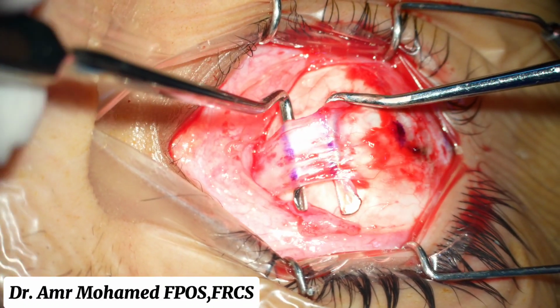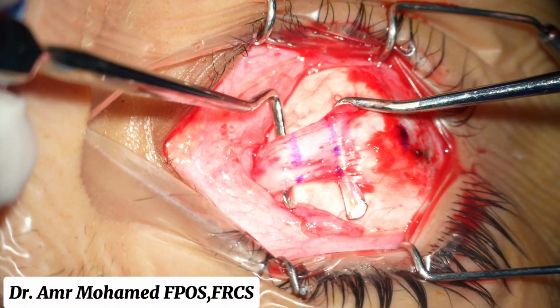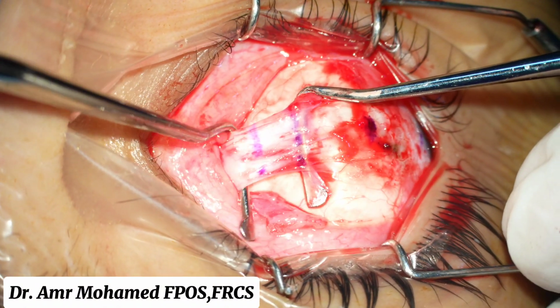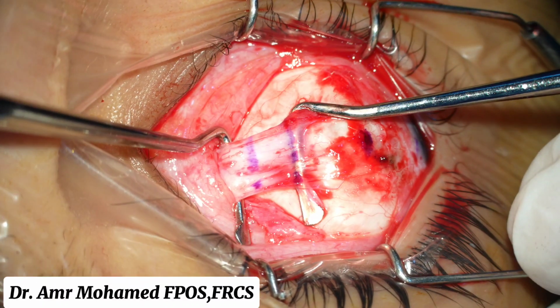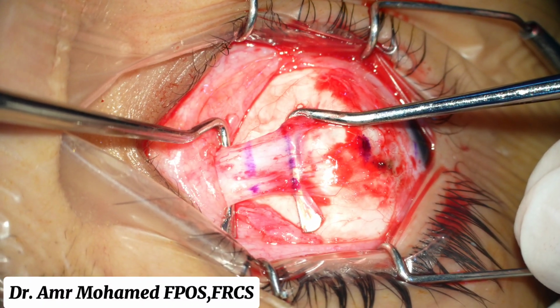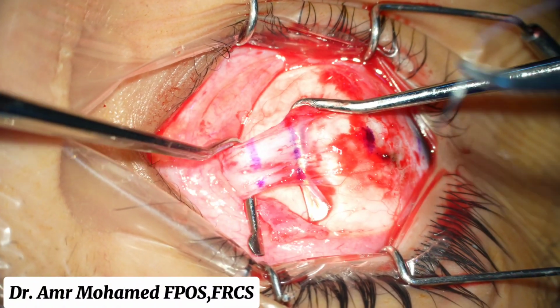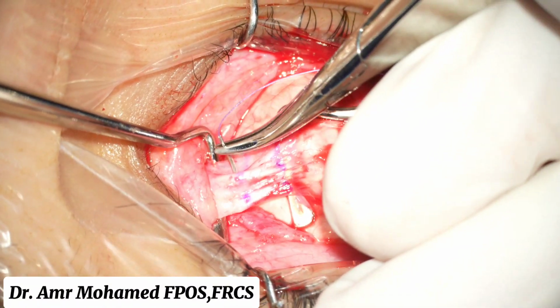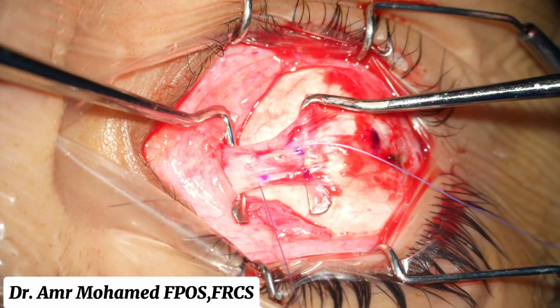So I did around 4 millimeter resection of that stretched scar or pseudotendon, so I will put the suture in the proper muscular tissue, so that will help in having more stable results and decreasing the chance of muscle slippage or stretched scar again in the future.